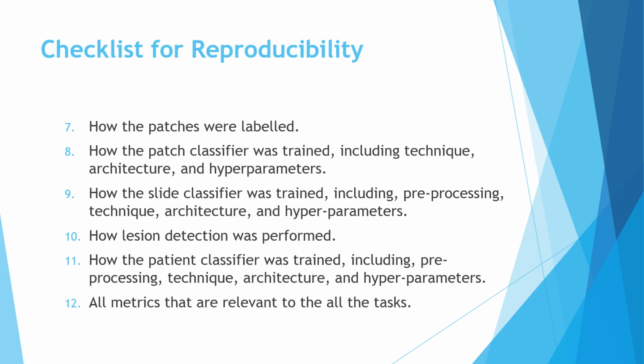If any classifier was trained to classify the patient, or any pre-processing method has been used, any specific technique and architecture have to be reported.